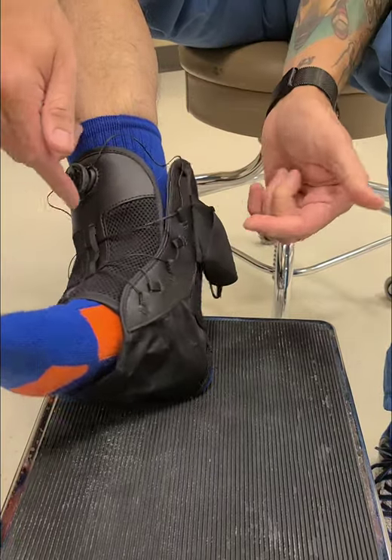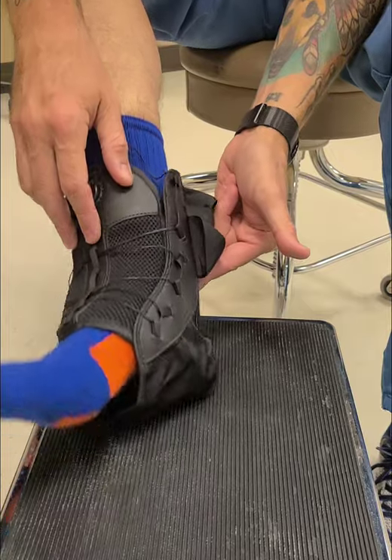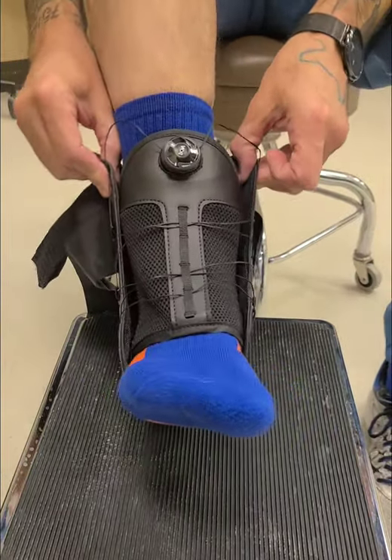Now, when I'm showing you how to tighten this up, I want your foot in a 90-degree position. I don't want your foot pointing downward. That's the position you should be in. So what we do is we get it on.